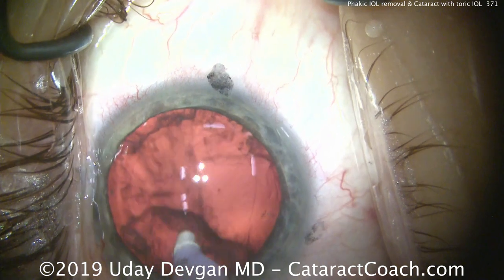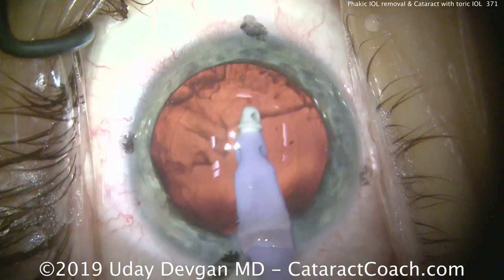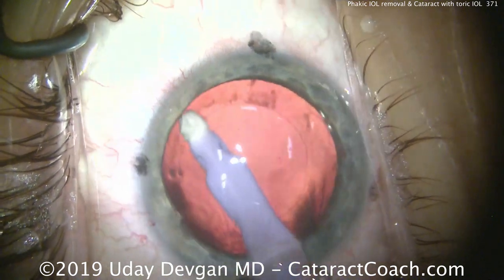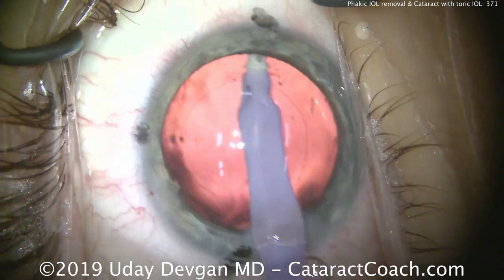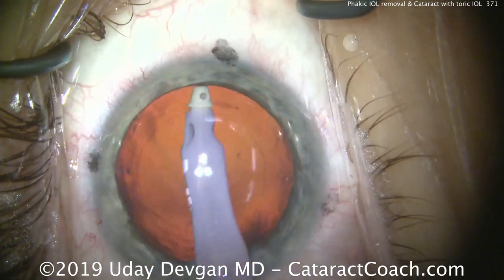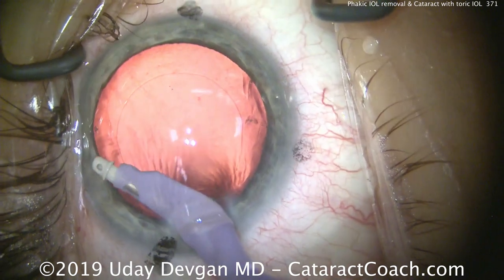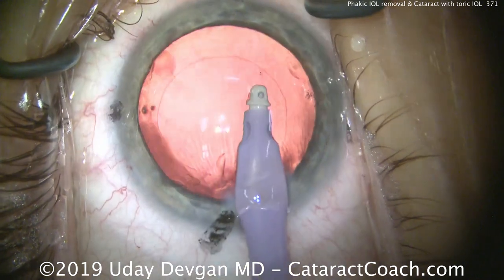If you look carefully at approximately the patient's 12 and 6 o'clock positions — remember, we're operating temporally — you'll see marks on the cornea. We've pre-placed those marks to delineate the steep axis of astigmatism. Now the cortex is removed, and we're going to polish up the capsular bag, getting everything nice and clean and ready for IOL implantation. Those marks you see on either side of the I/A probe are the toric lens markings.